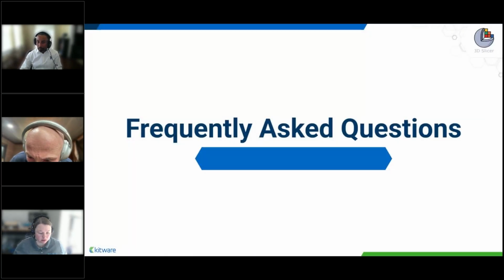Again, please continue to post your questions on the Q&A or chat. I see JC is busy answering some of these questions, and we'll be able to address as many questions as possible. Next, we want to take a moment to go through some of the frequently asked questions about 3D Slicer. No surprise, some of those questions already came up in the webinar, but these are some of the common topics that come up around using 3D Slicer for both product development or clinical research.